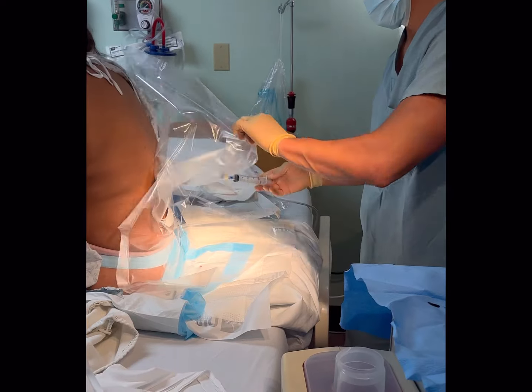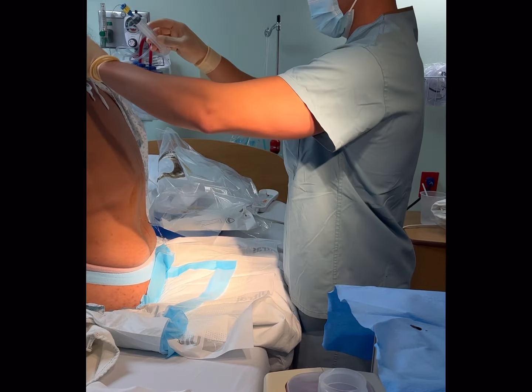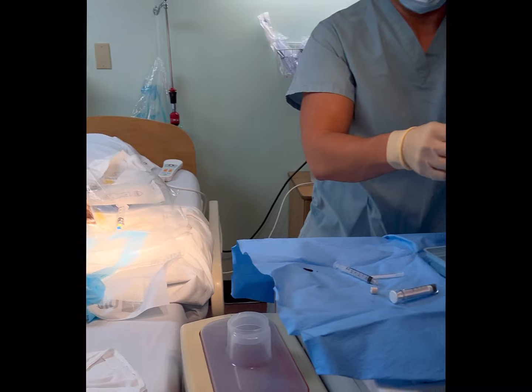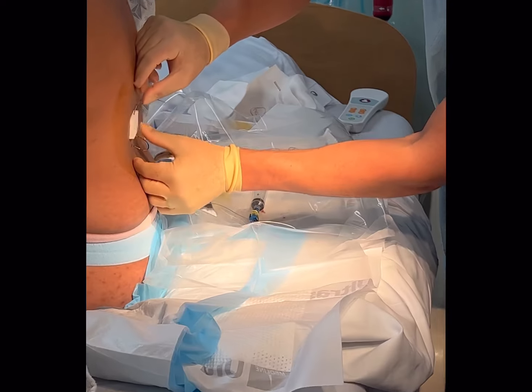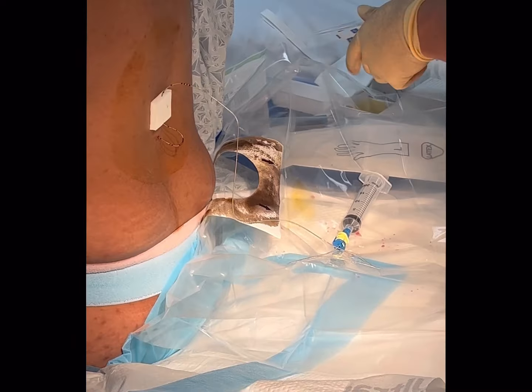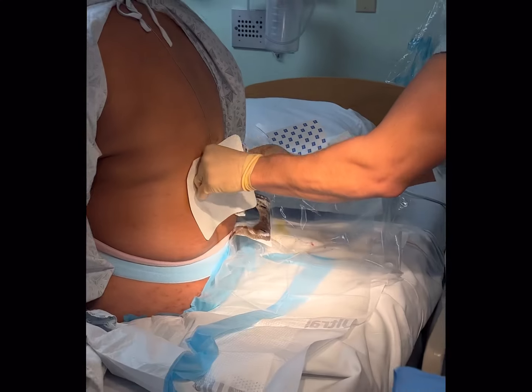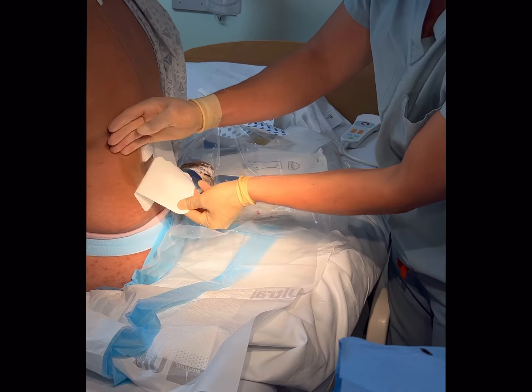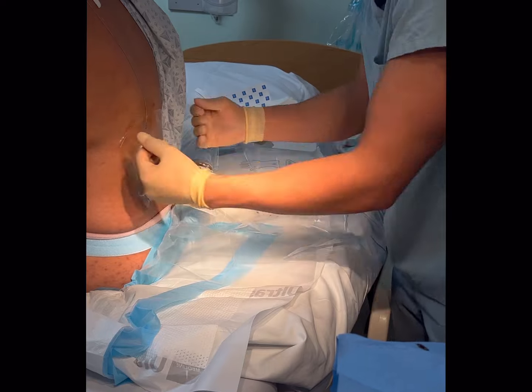That was a little bit more difficult than I would have anticipated — a lot of bone — but nonetheless we got it done. I'll apply my Tegaderm right there. Then I'll put some tape and we're done.